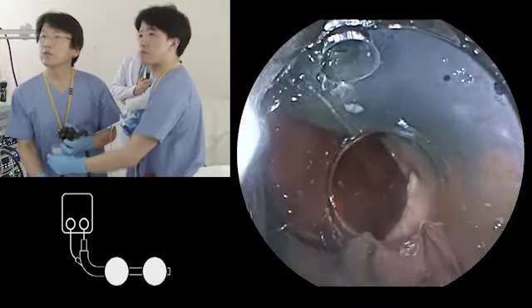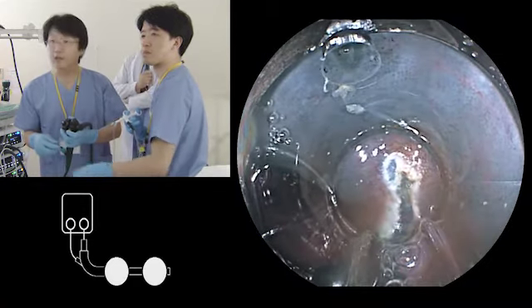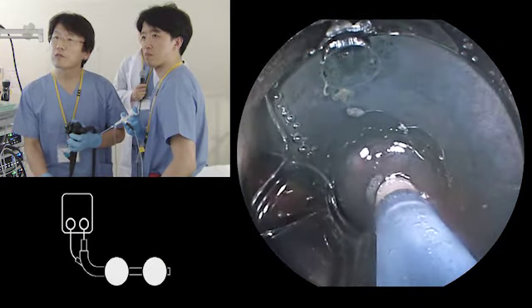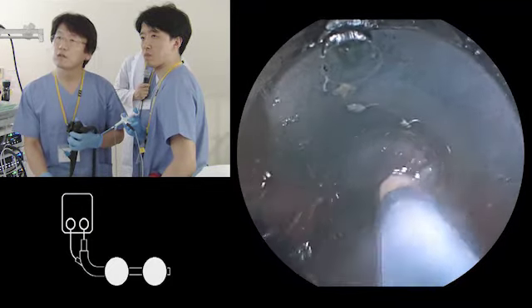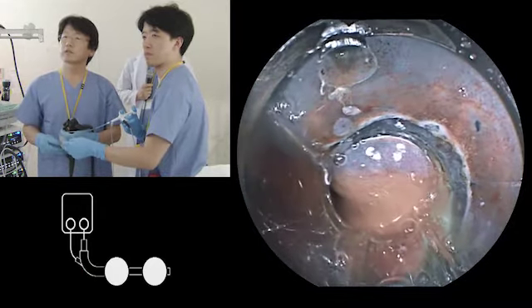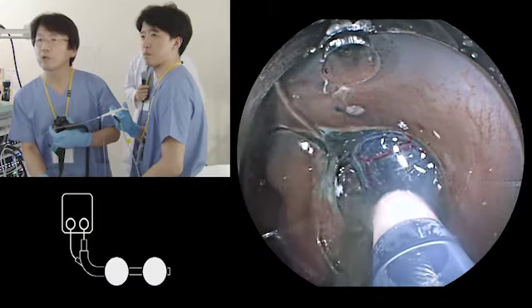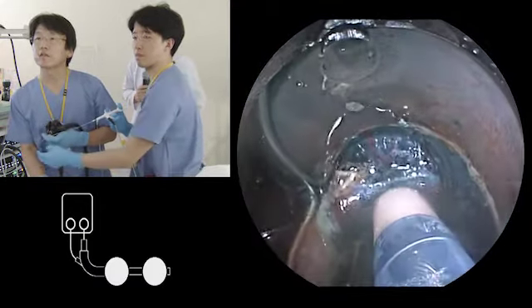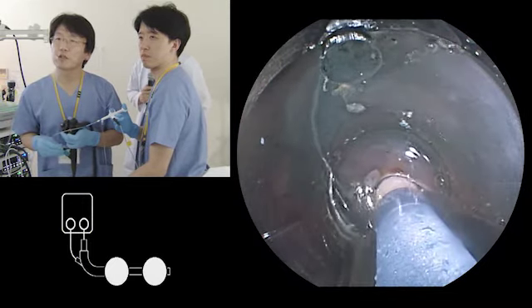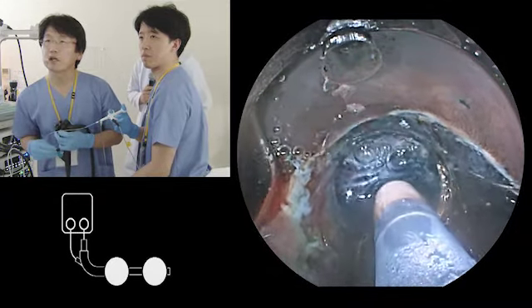So from here to here, maybe it is almost okay to cut the entire area, but for the educational purpose, I will cut just about a half. Okay, this is the edge of the lesion, so it's okay. And then the area where the mucosal incision is made should be dissected immediately, before the submucosal elevation is lost. In this way, you can keep a good submucosal elevation all the time.